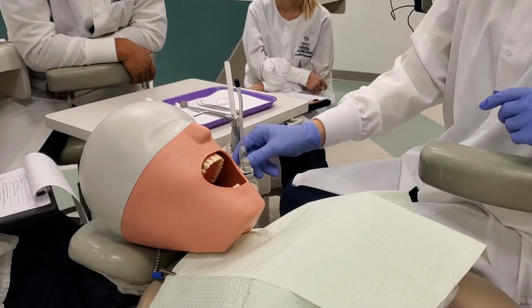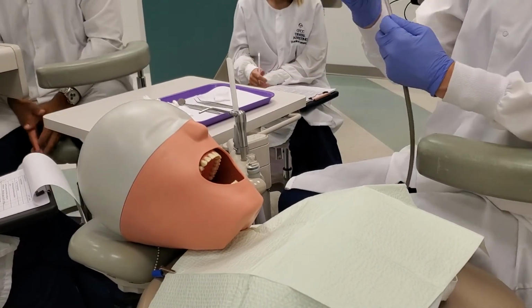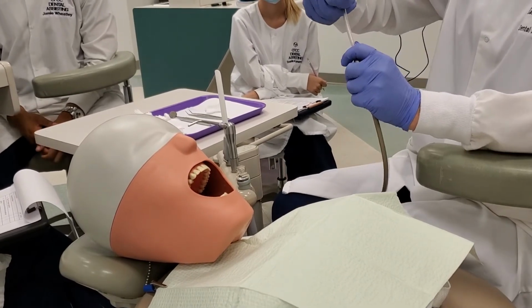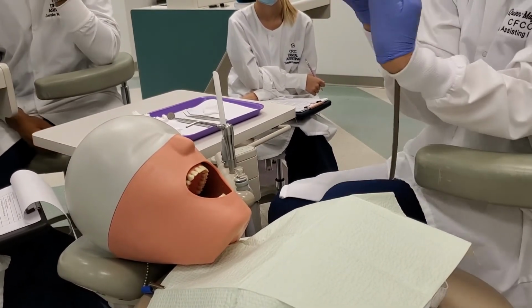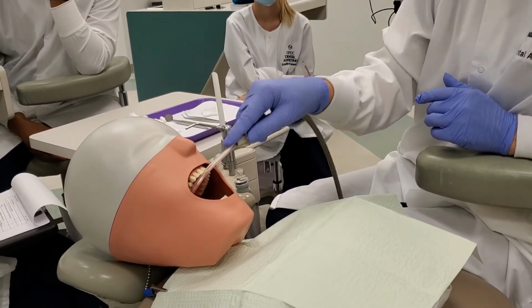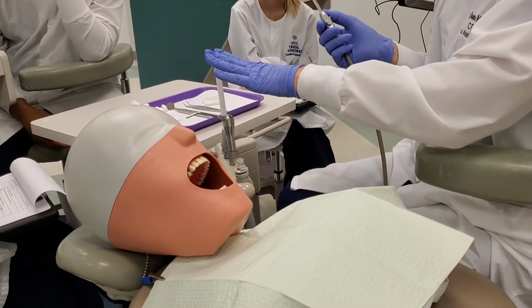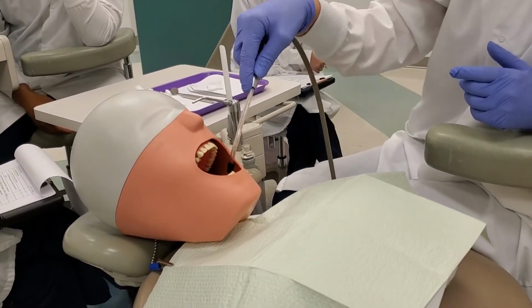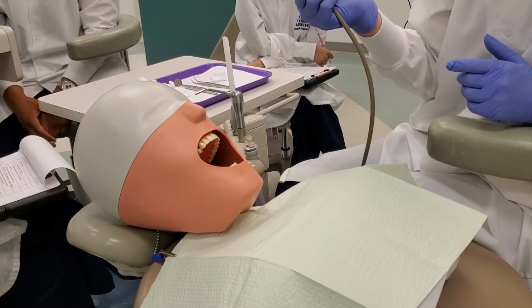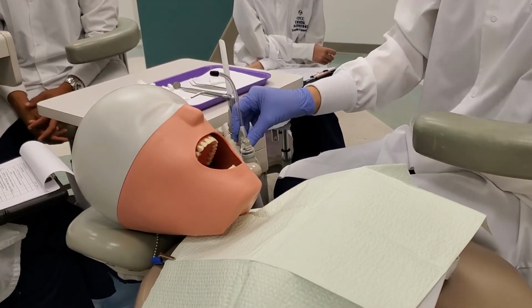All right. Now the saliva ejector, another easy breezy. So you have the saliva ejector. This will be straight. So you're going to shape the saliva ejector. All you have to do to shape a saliva ejector is just bend the tip, just like this. Okay? You don't have to mangle it all up. Just the tip. Because this is just in case you have a little bit of water here, a little bit of water there. It's not like a full bore pressure washer where this guy is concerned. This is great just to clear little parts where that's accumulating. It's a lot more gentle on the patient. Okay? Adjust the flow, place in the patient's mouth, like that. Okay, so that's it for the saliva ejector.